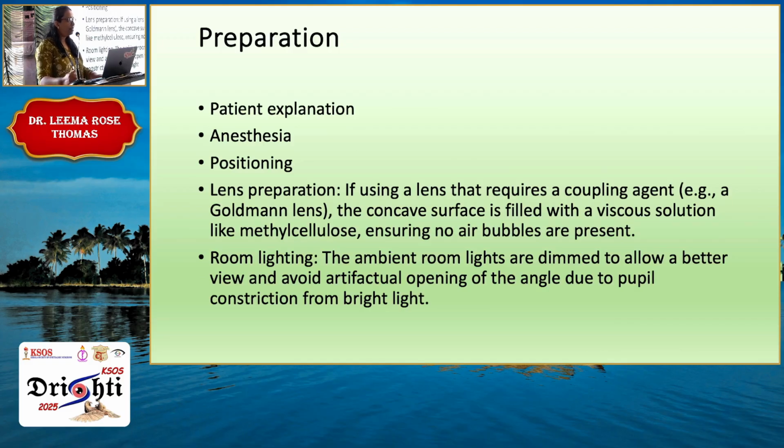And then as far as the 4-mirror lenses are concerned, you don't need the coupling fluid. Then room lighting: the ambient room light has to be dimmed to make sure that the angle is not getting opened up because of pupillary constriction.